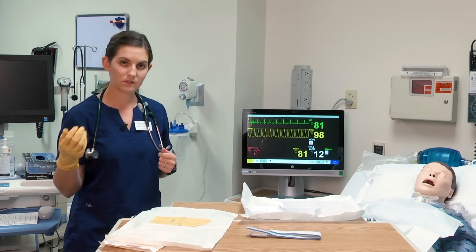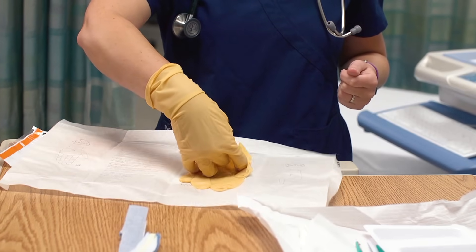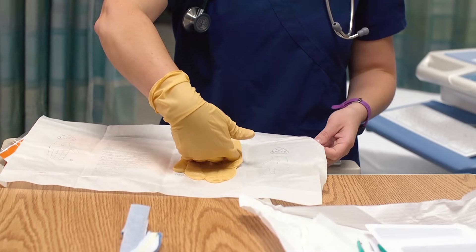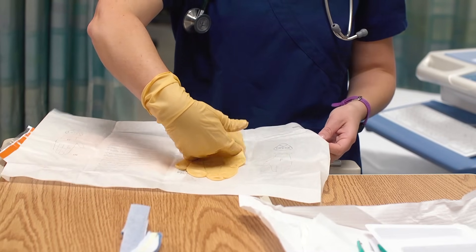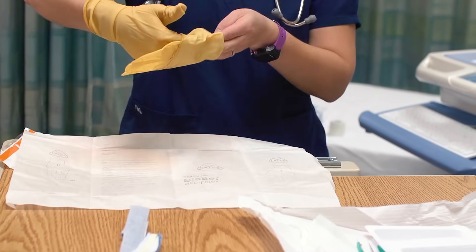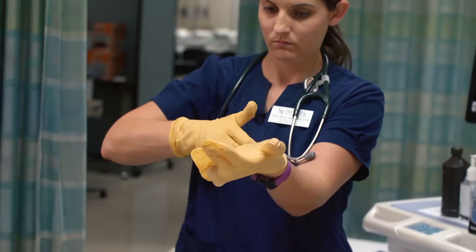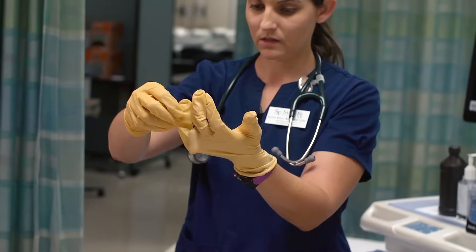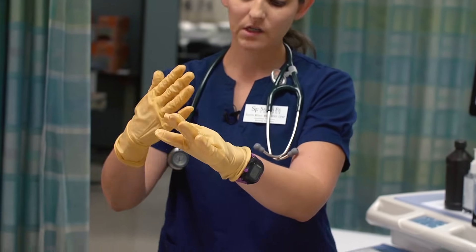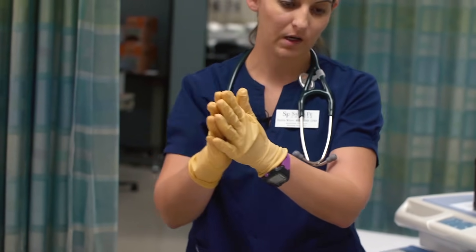Next I'm going to put on my second sterile glove. I cannot reach below my wrist — if I touch below my wrist, I have contaminated my gloves.